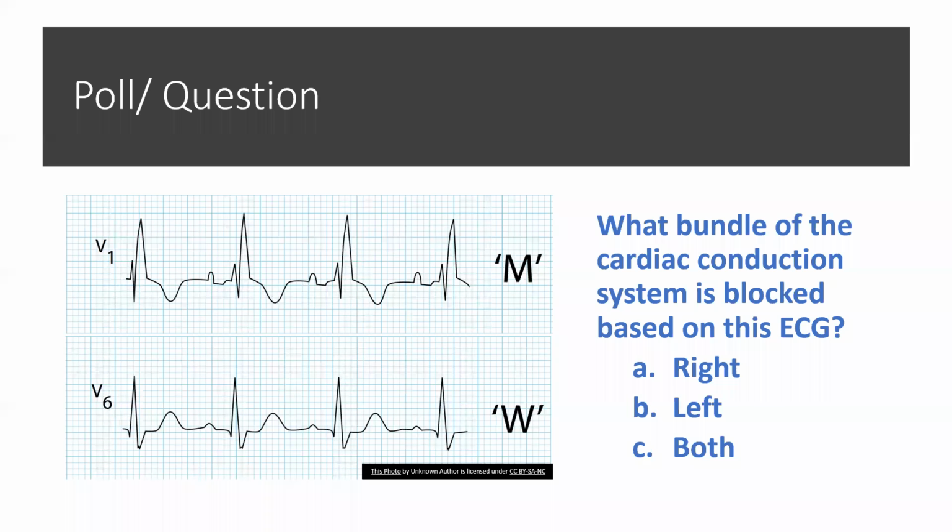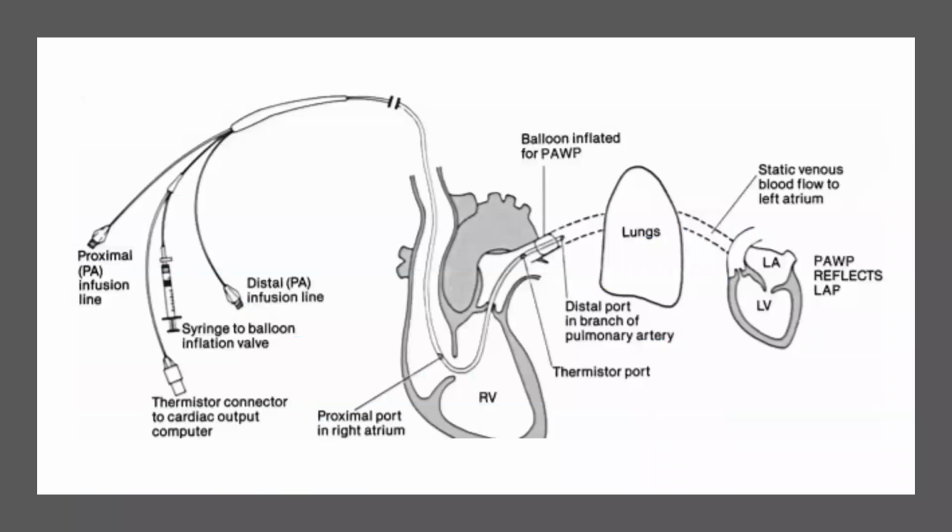Okay, having dispensed of that, let's go ahead and take a look at the hemodynamic principles that are associated with the insertion of a pulmonary artery catheter. So illustrated over here is the system upon which we're going to try to understand the hemodynamic implications of the insertion of a pulmonary artery catheter.